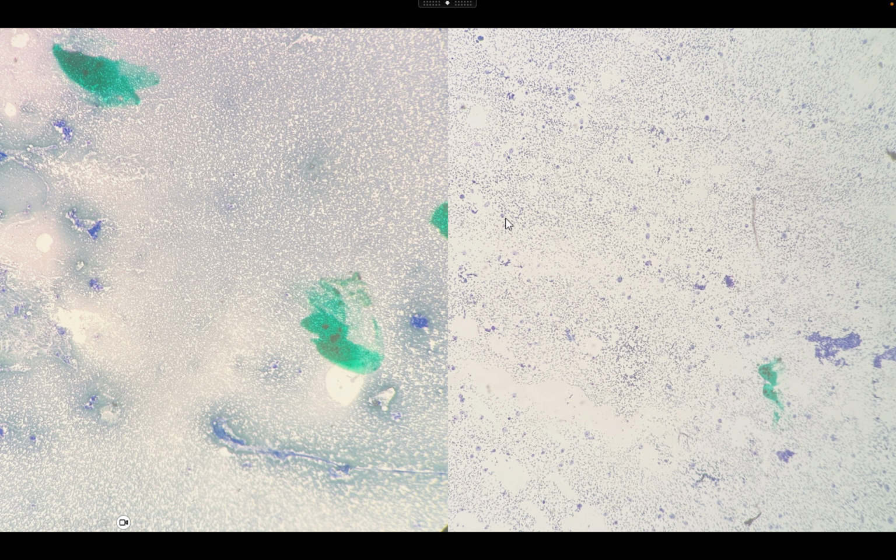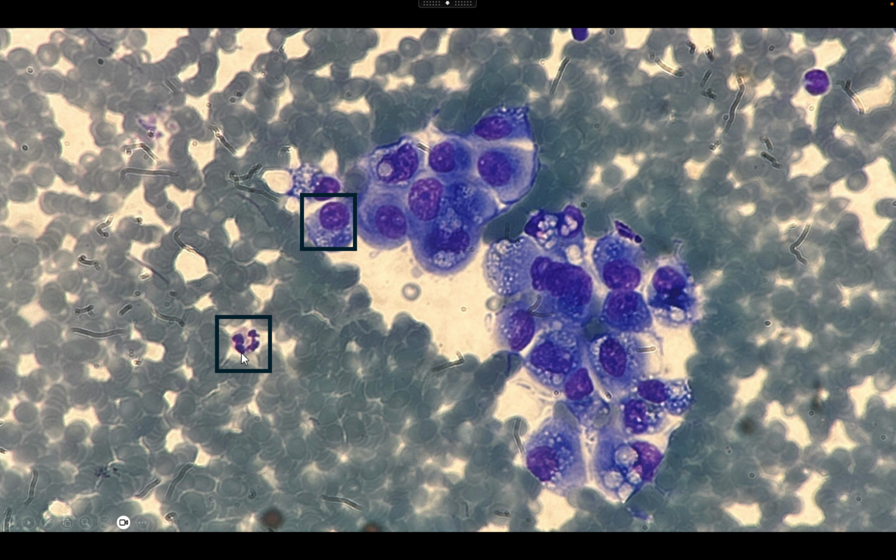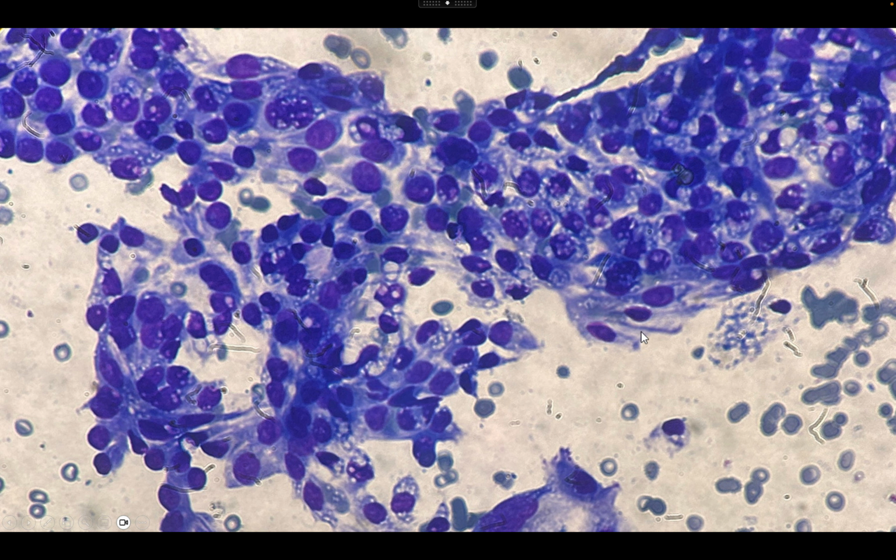You can appreciate this cystic degeneration with a lot of macrophages. But as we look closer, we can see that these cells were bubbly and vacuolated, maybe suggesting cyst lining cells. However, these cells were pretty enlarged compared to your adjacent neutrophils, at least 1.5 to 2 times as large. This view really suggested how these cells look like cyst lining cells. They got this strung out appearance. The nuclei are elongated. However, these cells were unusually large compared to your red blood cell.